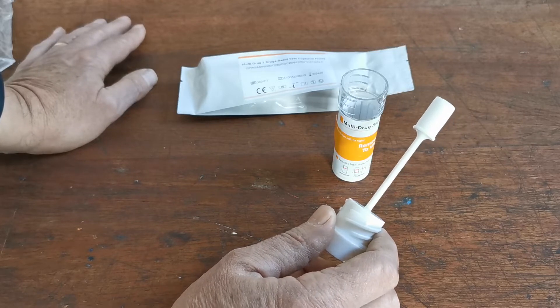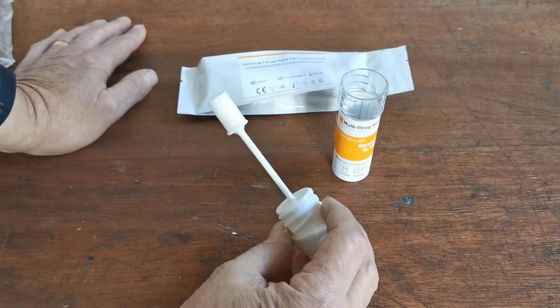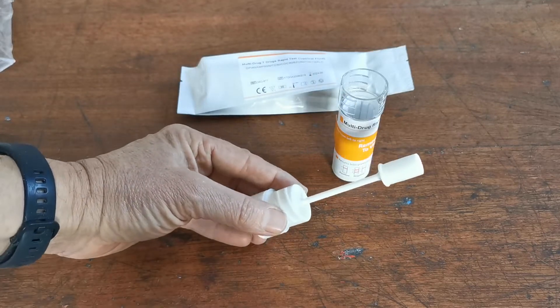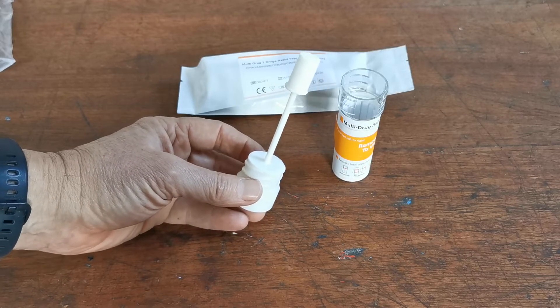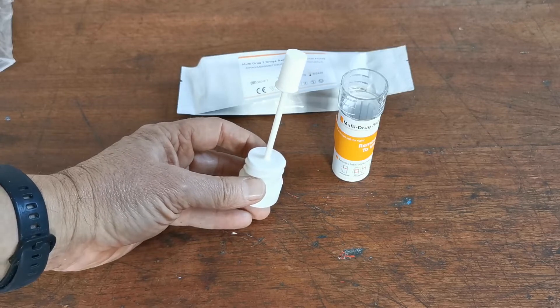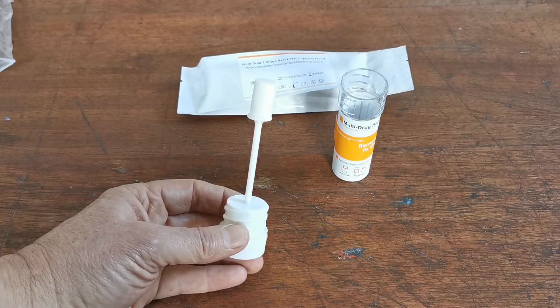The swab should be moved around both top and bottom teeth, around the oral cavity gently, under the tongue, and over the tongue. It will take approximately five minutes to get an adequate sample. It is absolutely critical, particularly to accurately detect cannabis, that this swab is moved very thoroughly around the oral cavity.